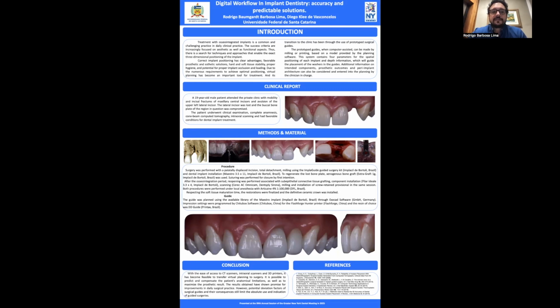The guide was planned using the available library of the Maestro implant through Exocad software. Printing settings were programmed by Chitubox software for the FlashForge Hunter printer. The resin of choice was DD Guide from Printax.